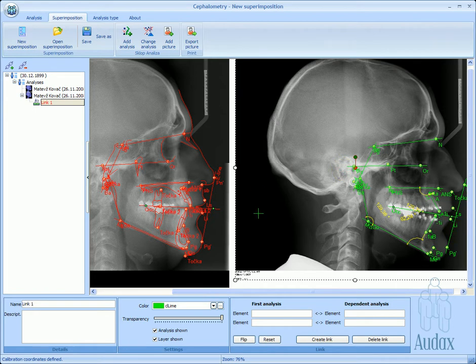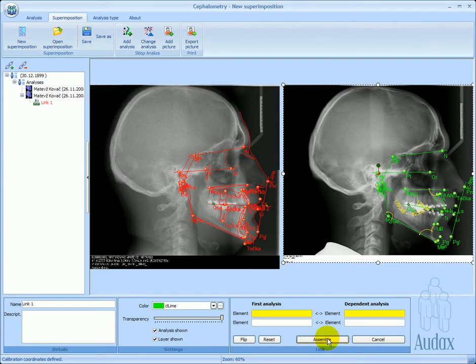Assemblies are created based on different diagnostic requirements, for example, aligned with the SN plane, nasal plane, or mandibular plane.